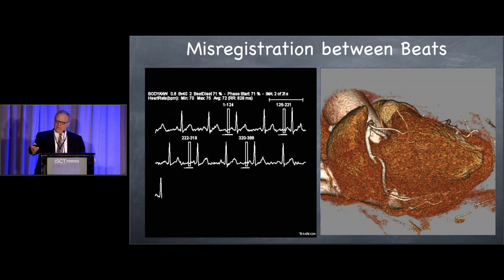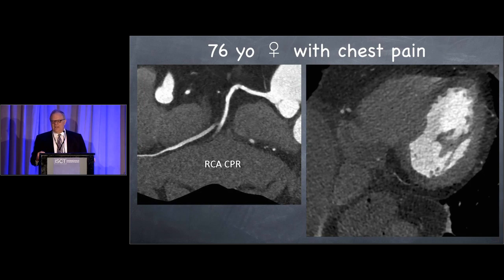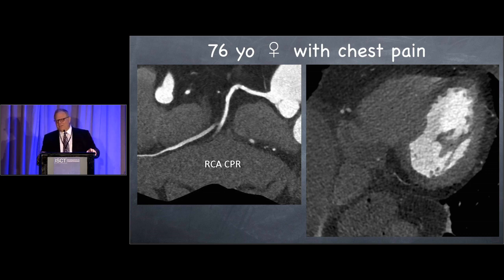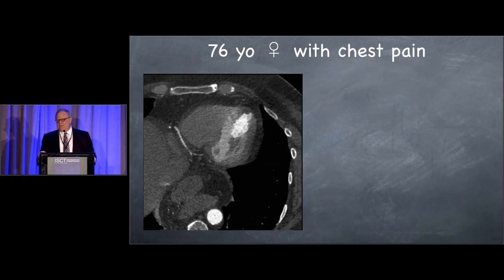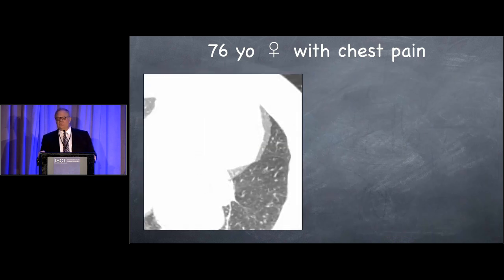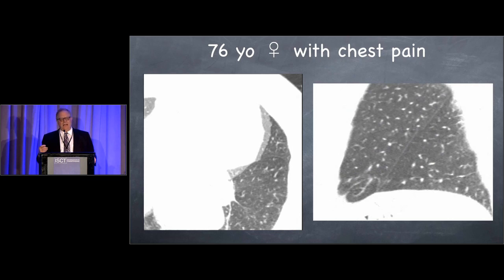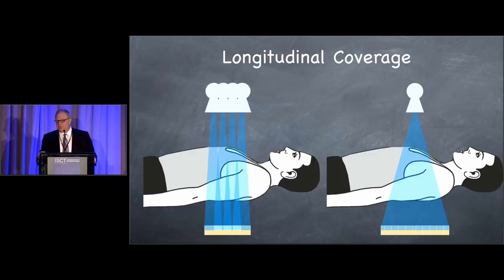Here is another patient where I want to draw your attention to the right coronary artery, where it looks like there is a blind-ending branch that might be occluded. But if you look critically on the curved reformation, we see two apparent right coronary arteries right at the site of that branching point on the transverse section. The lung window — a great way to see motion — shows how much misregistration there is. This is an example of patient motion occurring at the interface on a prospectively triggered scan.